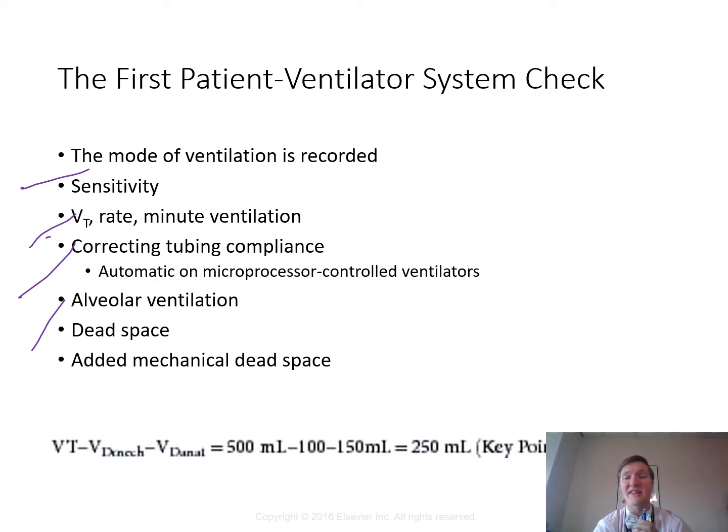So when we're looking at the tidal volume, yeah, it's still delivering it to their lungs, but how much of that is participating in alveolar ventilation, right? How much of it is actually participating in gas exchange? Minute ventilation is great. It's how much gas is going in and out of the lungs, but that includes the conducting airways where there's no CO2 and O2 exchange. Alveolar minute ventilation is where there's CO2 and O2 exchange, and that's what we care about.